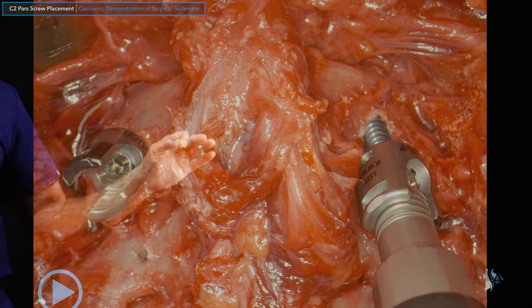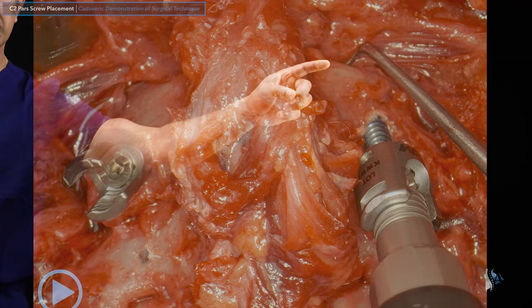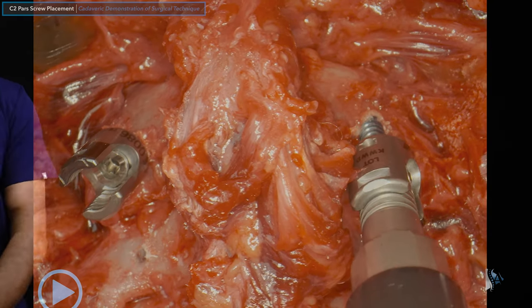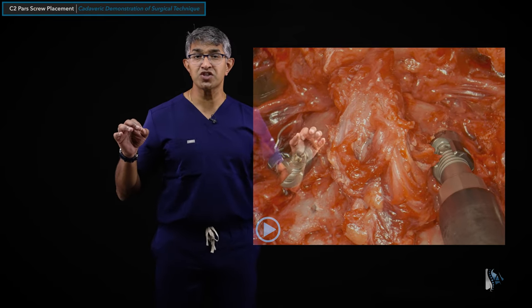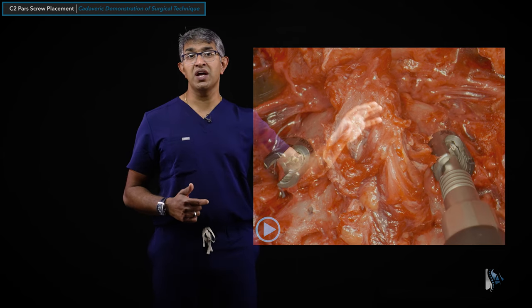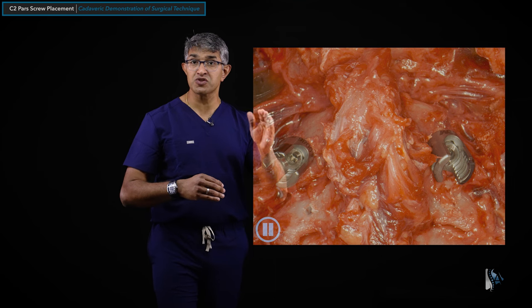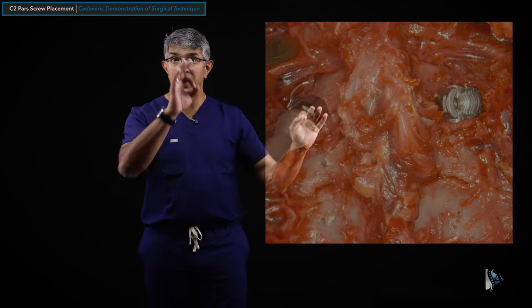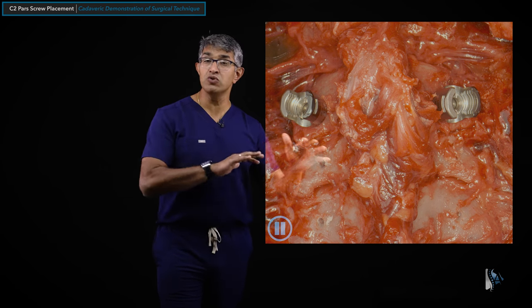About halfway down, in this cadaveric demonstration you can come in with a nerve hook or a Woodson to really feel the borders of it — here's my screw, here's the medial border, here's the top border — and I'm just hugging it the whole way in to stay medial and stay away from that vertebral artery. Once both screws are placed, I'll check an x-ray if using fluoroscopy. I routinely use fluoroscopy when doing a C1-2 fusion, primarily for the C1 screws, and in those situations I'll check an x-ray at the end to confirm position. That is how I put C2 PARS screws in under direct visualization — using the correct landmarks and appropriate start points. These tulips will line up nicely with sub-axial screws. Once everything is in, I'll align the tulips with a head turner to make sure they're all aligned. That's what I want it to look like bilaterally.